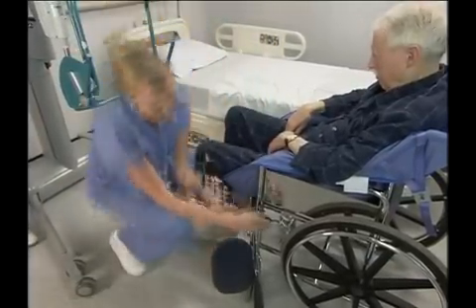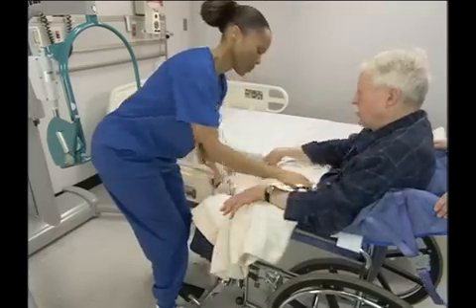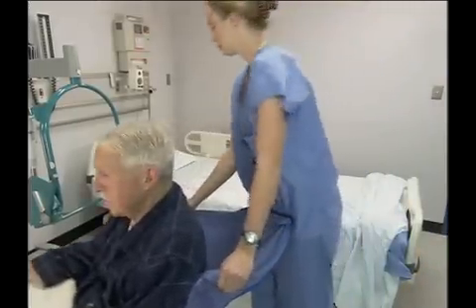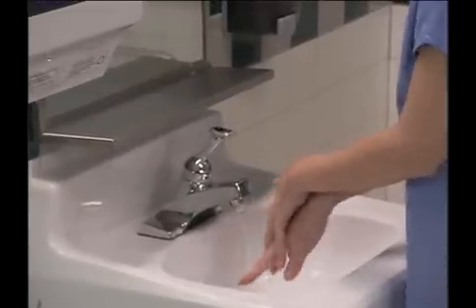If a lap restraint was ordered, position it now. Otherwise, provide a lap blanket as needed, making sure it doesn't drag on the floor. Finally, position the wheelchair according to the person's preference. Then complete your finishing up steps as described in the final section of this video.